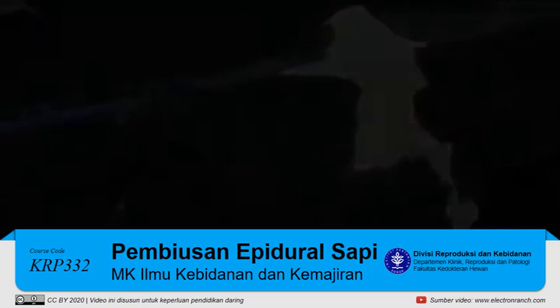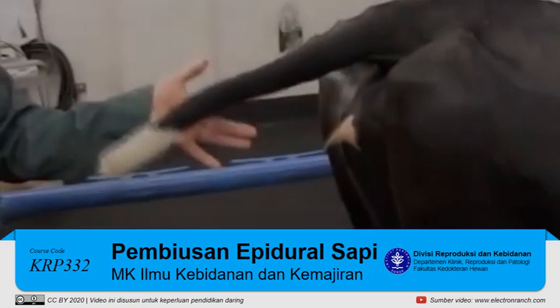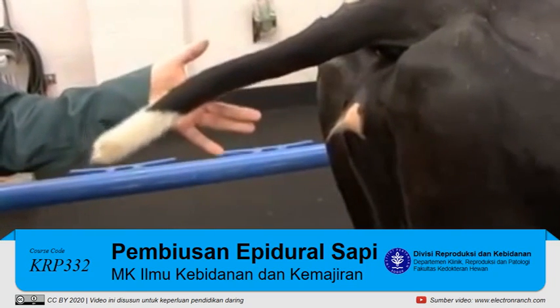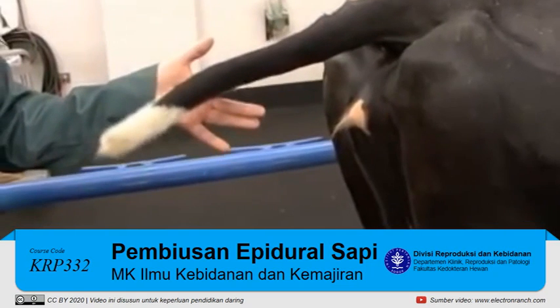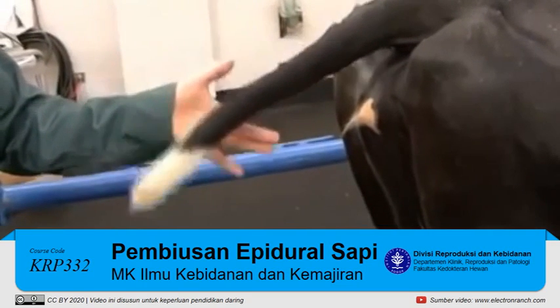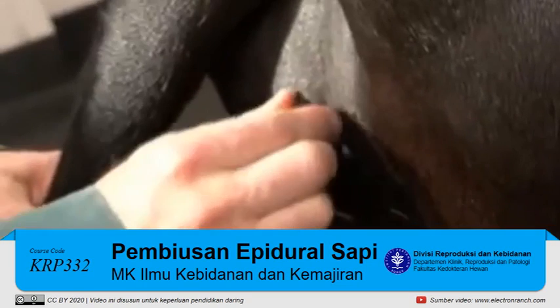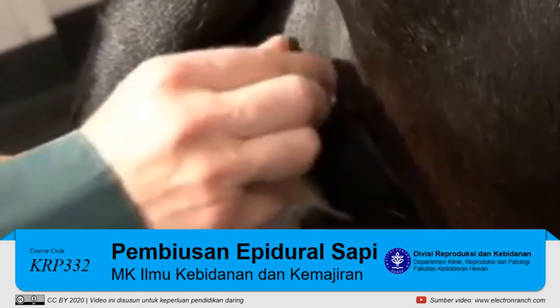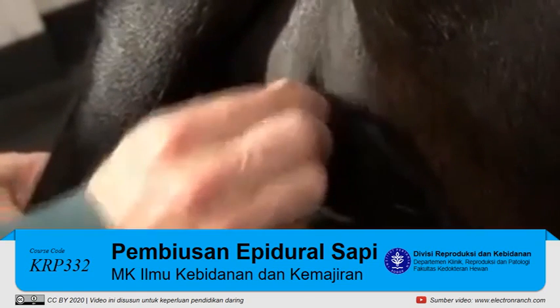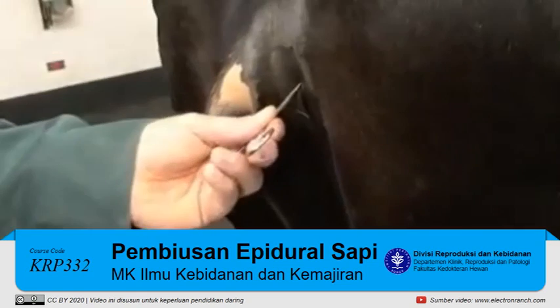When finished with the injection, remove the needle and syringe and allow approximately three minutes for the anesthesia to take effect. You can check the efficacy of your block by evaluating the tail tone of the patient — the tail should be flaccid and easily lifted. Pinching the skin around the vulva should also elicit no reaction from the patient following a successful epidural injection.